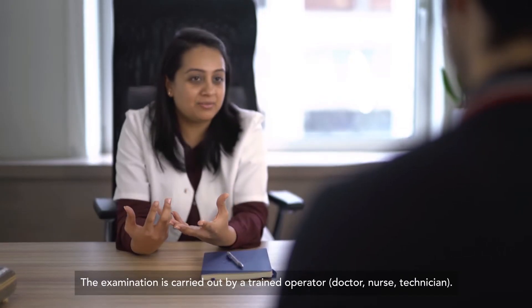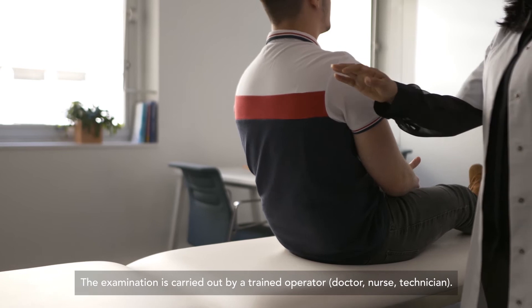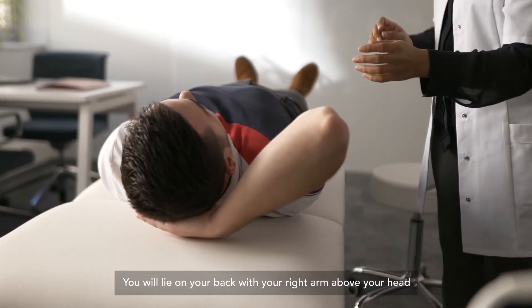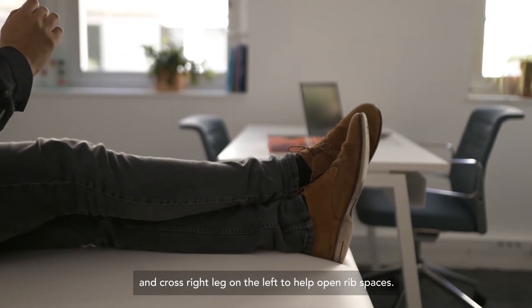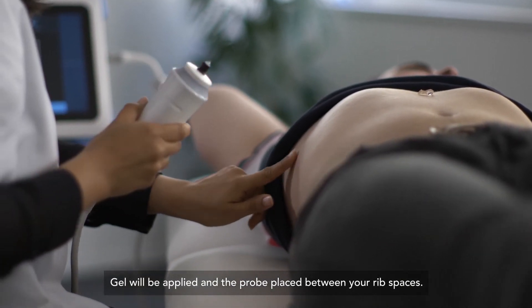The examination is carried out by a trained operator — doctor, nurse, or technician. You will lie on your back with your right arm above your head and cross your right leg on the left to help open rib spaces. Gel will be applied and the probe placed between your rib spaces.